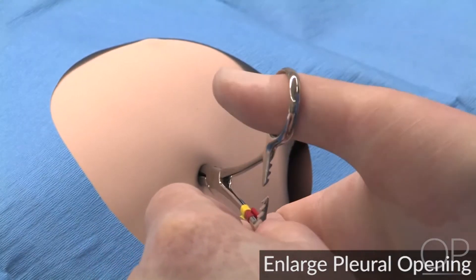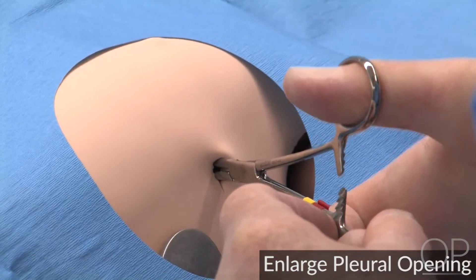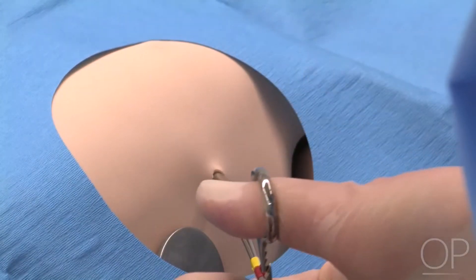Enlarge the pleural opening by spreading the Kelly Clamp open. Remove the Kelly Clamp.